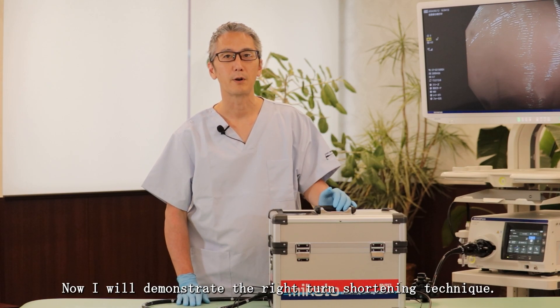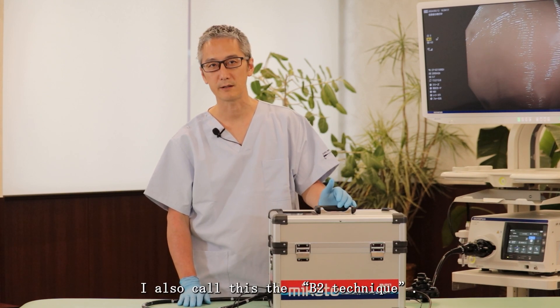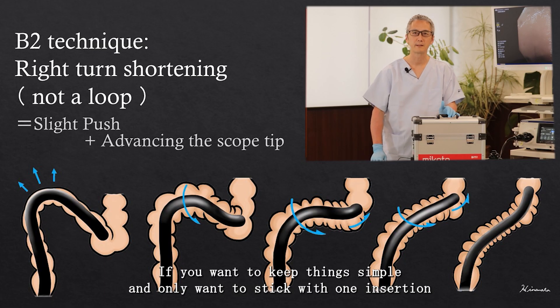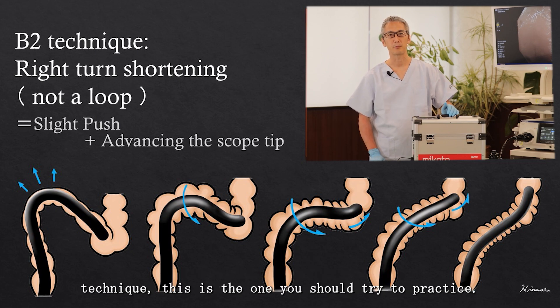Now I will demonstrate the right turn shortening technique. I also call this the B2 technique. If you want to keep things simple and only want to stick with one insertion technique, this is the one you should try to practice.